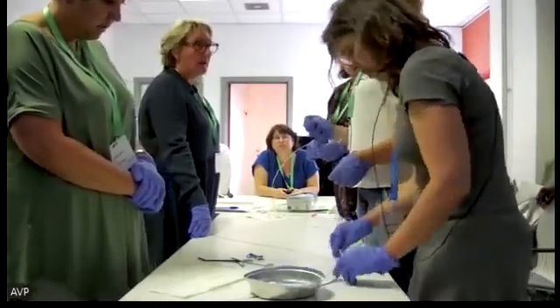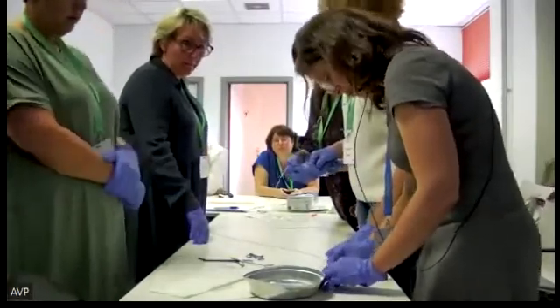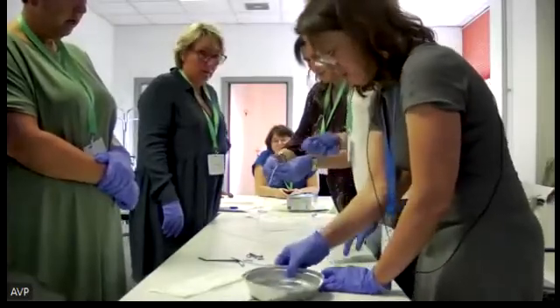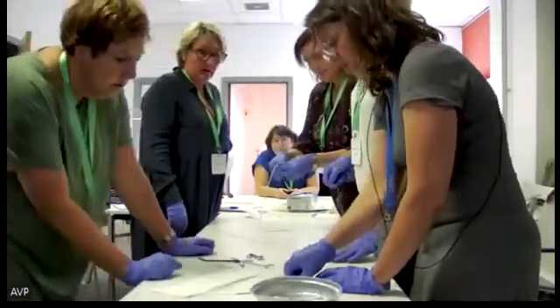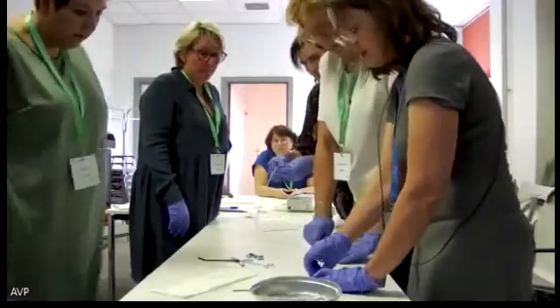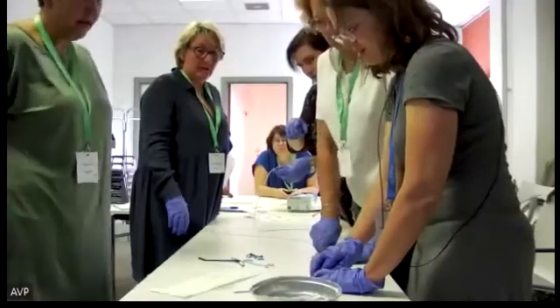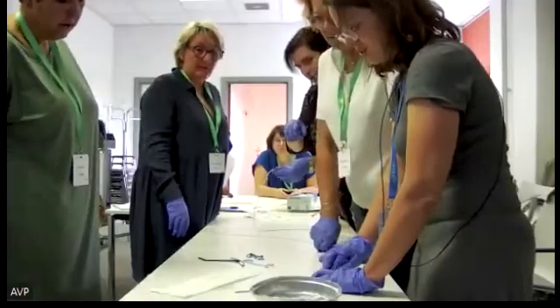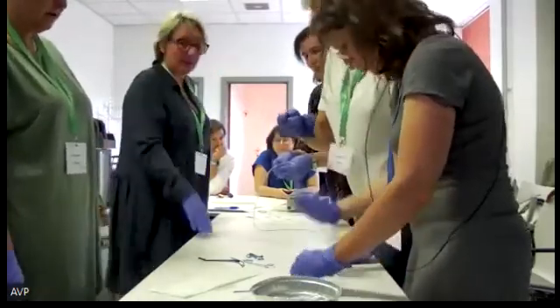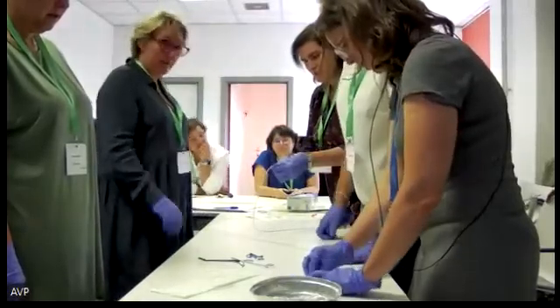Et donc, on fait ça. And afterwards, when we have put the stent, pushed the stent inside, when we're ready, now we will, the operator outside from the scope will bring it back just to release the tip. And you see it on the scopy screen, tac, tac, tac, there, so flaps, it's released. We readapt et puis on release les trucs.